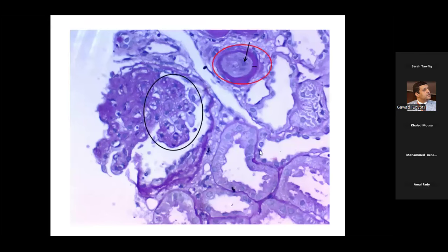Another picture, and I would like you to say whether the segment of the capillaries in the black circle are occluded or empty. It is occluded, right? By cells, I mean by nuclei mainly, or something else? I will let them answer. We have nuclei or something else.